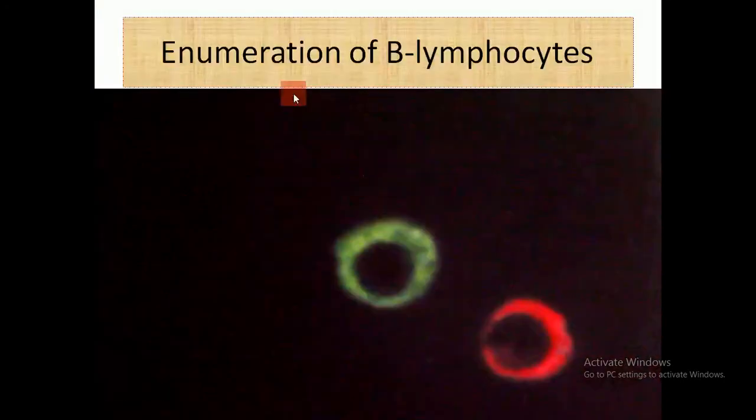Second function, the enumeration of the B lymphocytes. As you know, the B lymphocyte has antibodies on its cell surface, and then we add to it the conjugate, and this is the direct immunofluorescence, and then examine under the fluorescent microscope, and we see the cell wall of the B lymphocyte will be apple green and fluoresce.